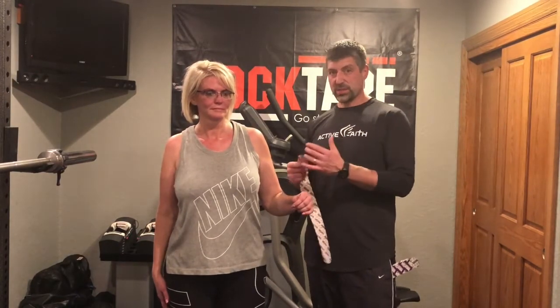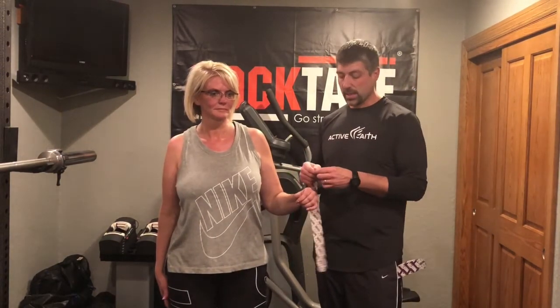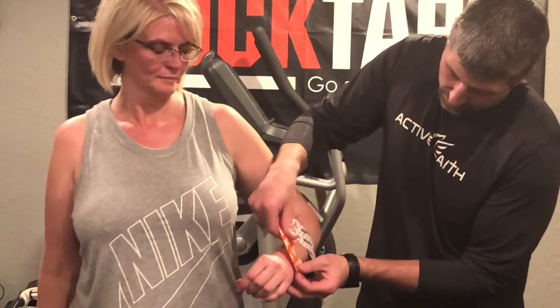What we're going to do is a double helical pattern. We teach the helical patterns in our basic and performance courses through RockTape, but we don't do it in this way — this double helical is a little bit unique. I'm going to start with my anchor on the back side of the wrist and forearm first.